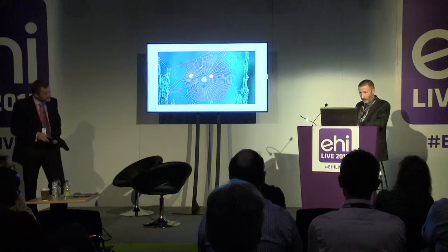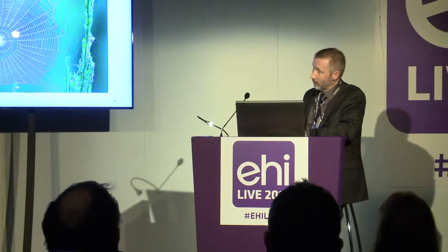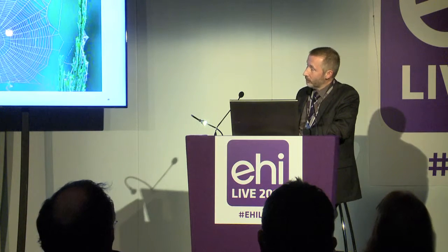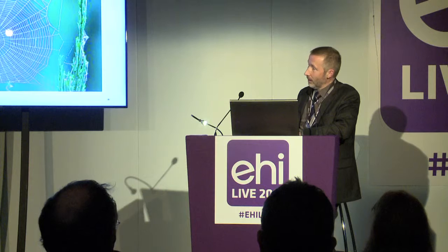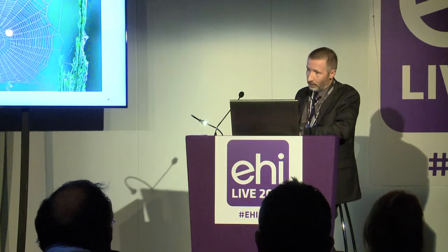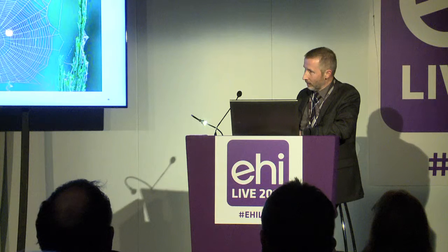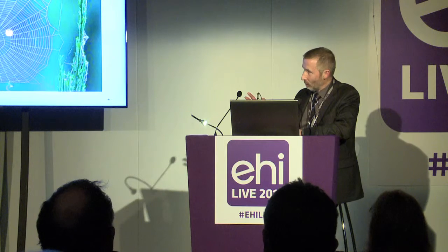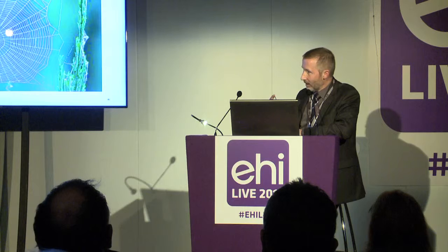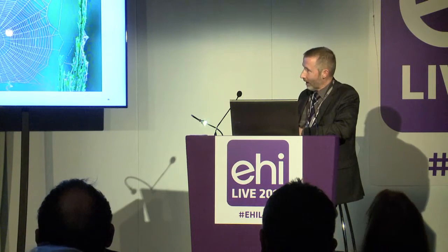Fundamentally, if you've got a big RIS-PACS infrastructure, it's sitting there begging to store all the images. Because the way we store images at the moment for all the other ologies can be reasonably good, but it can be woefully inadequate, and often is. And the previous speaker talked about the difficulty of, even when you go to try to sort things out a little bit, you find that there's complete chaos and mayhem, and therefore you need to have solutions which sort out the little guy who makes a few images a month, and the big guy like cardiology who produces thousands and thousands and thousands. So you need solutions that work at the low level and the high level.